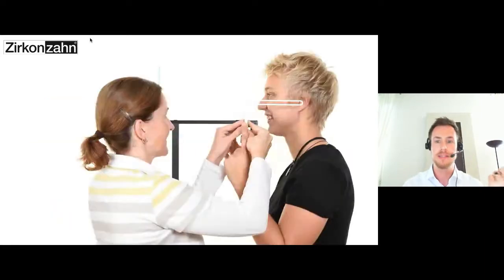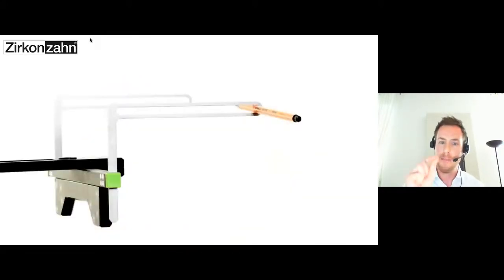But before we do that, we have to be sure that the patient is able to align the head position at any time at the same position. We have to control that, and we use a kind of control angle. As you can see here in the picture close to the patient's head, this kind of angle with the open space in between where you can put a pen through.